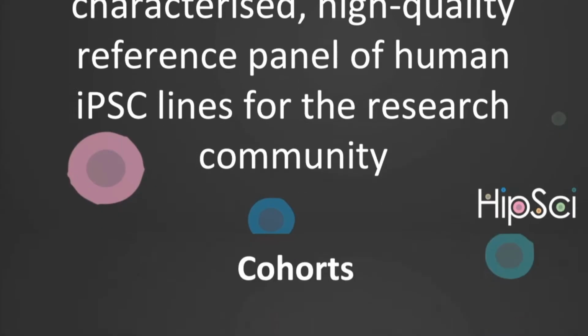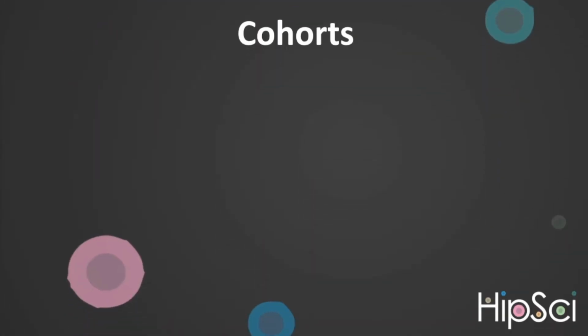This video and its associated document demonstrate how to navigate through our cell line browser and purchase a line of interest. Working with clinicians from across the UK, the HipSci project has successfully obtained tissue samples from volunteers across 16 cohorts. Our largest cohort by far is our healthy volunteers. We believe they provide a powerful resource to study common variation within the human population. This then helps to better understand disease.